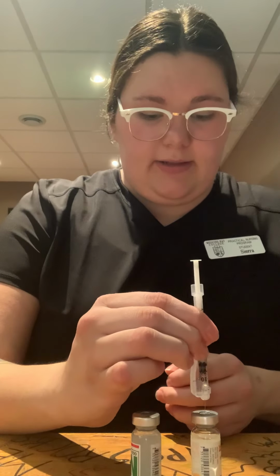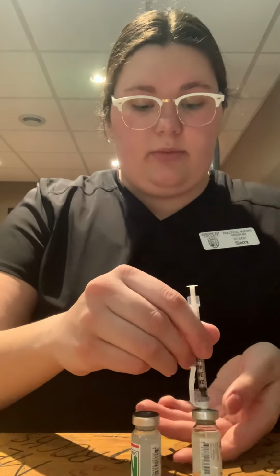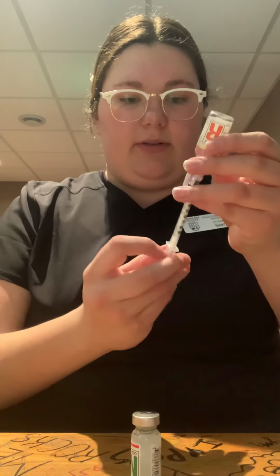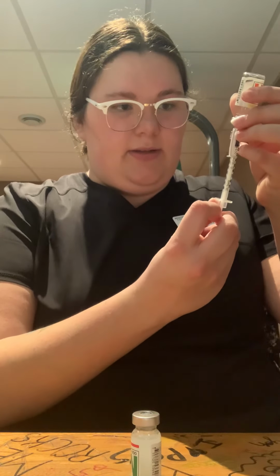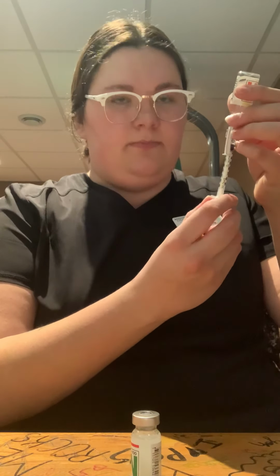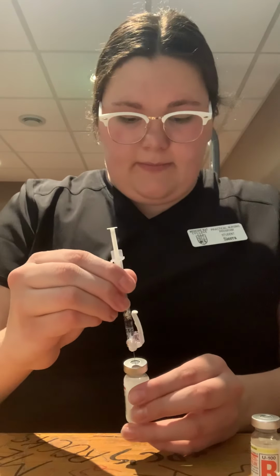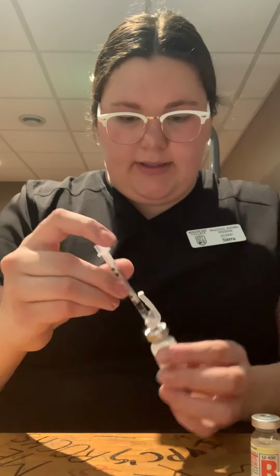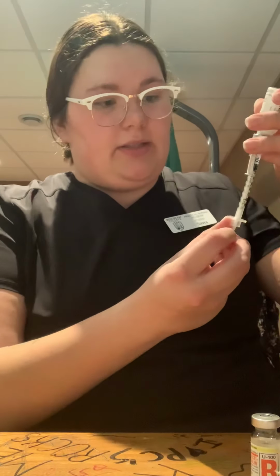So right in, all the way in. And this time we're not going to take it out. We're going to flip it upside down and take it right out. So we're going to take out 20 units. And then right out. And then we're going to go right into our Humulin N and take out 10 units of Humulin N, totaling 30 units of insulin.